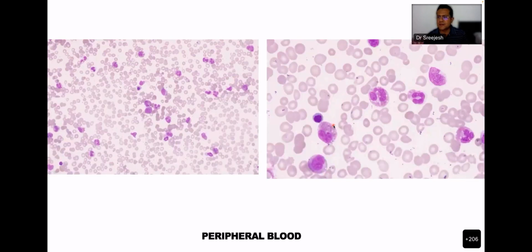What is the morphological diagnosis of this male? Sir, chronic myeloproliferative neoplasm, most likely. Most likely chronic eosinophilic leukemia. I want to say chronic myeloid leukemia. No, chronic myeloid. That should be the commonest reading in this case.